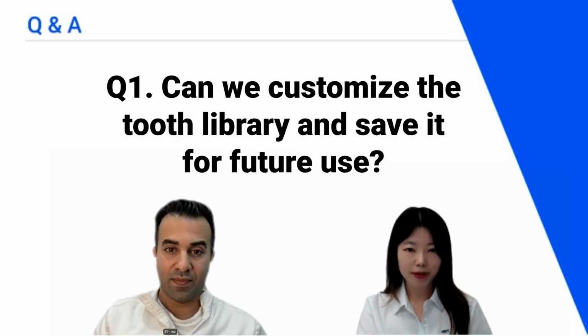Okay, so today we have three questions total. I'll start with the first one. Question number 1. Can we customize the tooth library and save it for future use?